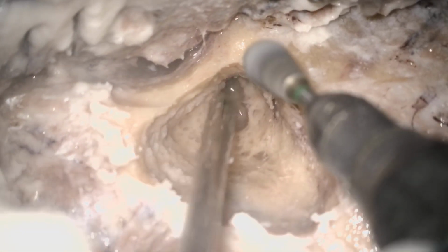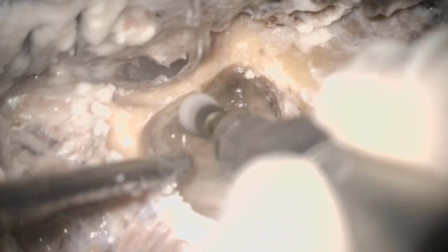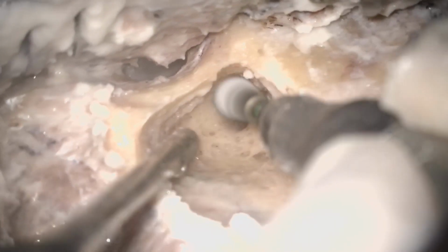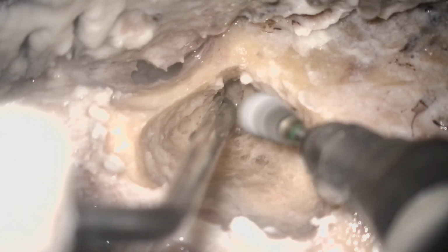Hello, sir. What should be the ideal thickness of the canal wall in cortical mastoidectomy? Ideal thickness? Look, if you identify the lateral semicircular canal as well as the facial recess area, then it is good. In many cases, the canal is not straight.